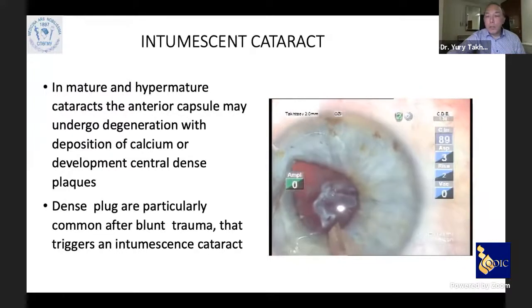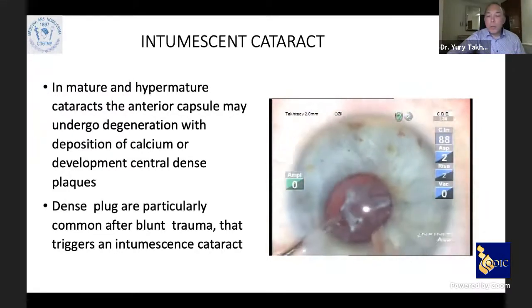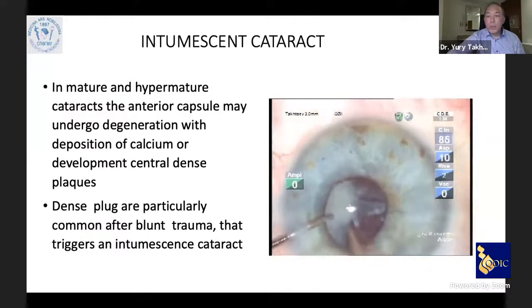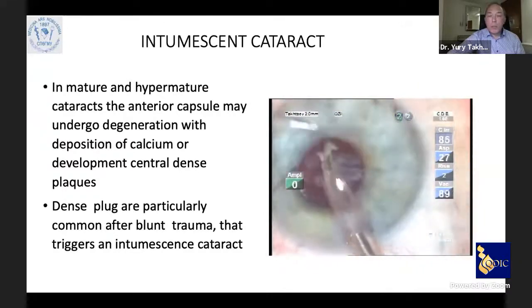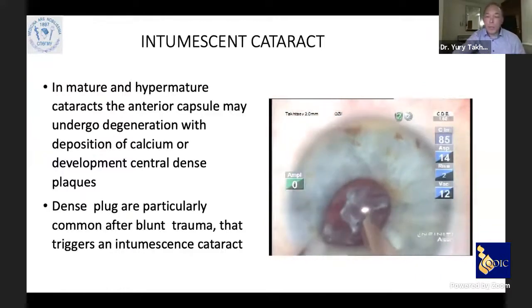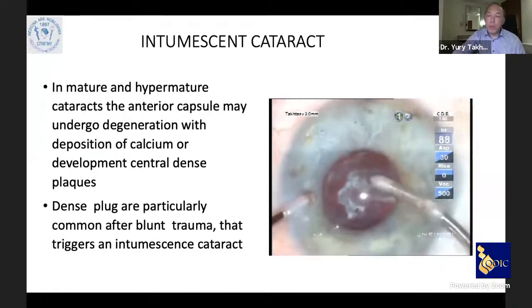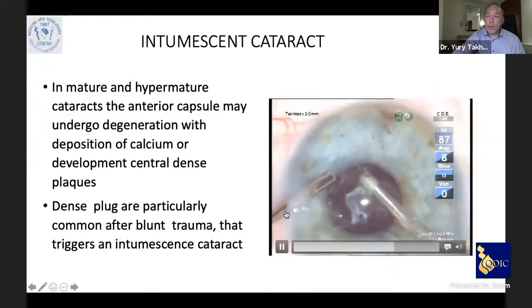And you just look around behind the iris and you can see the strong fibrotic tissue. Check the residual cortex as well. This is a surprise to me at 12 o'clock. This is the last piece of the cortex. And then we decide to remove this plaque and keep the posterior capsule intact. With the needle, we just separate the fibrotic tissue from the posterior capsule, polishing a little bit in the periphery.